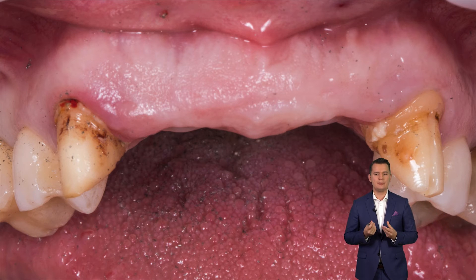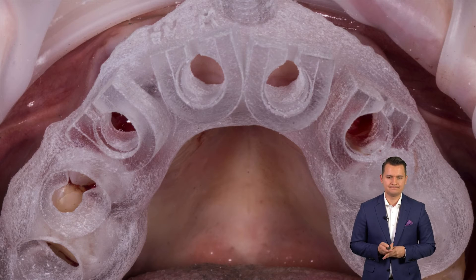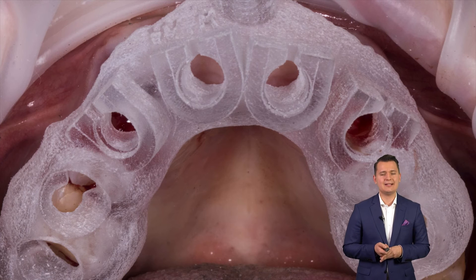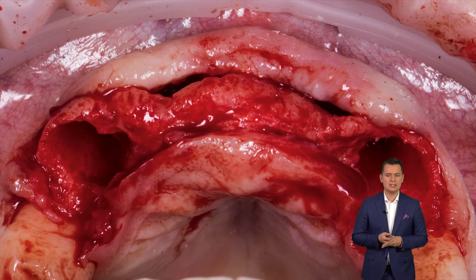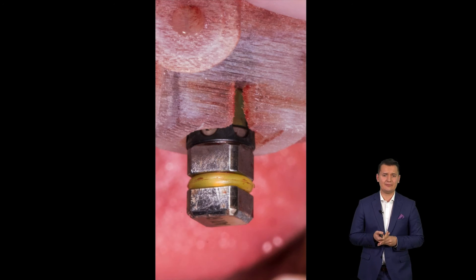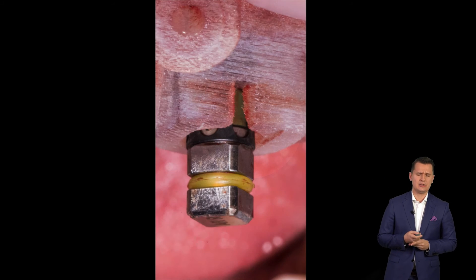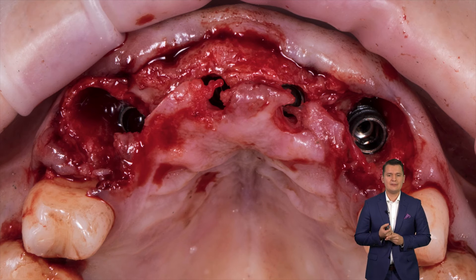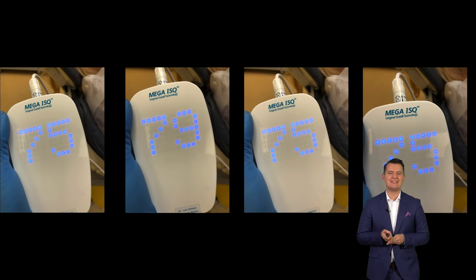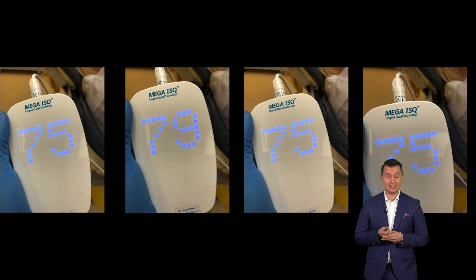Starting from the surgery: we remove the bridge, extract the canines, and create the flap. I always check the fitment of the guide before creating the flap to place the implants. All implants were placed according to the planned position and depth. In cases with more than one implant, I don't use hex abutments — the hex position is not important. We placed four implants and checked primary stability. With the Enrich implant I got amazing results: 75, 79, 75, and 75 ISQ. I was sure I could load these implants without any issue.